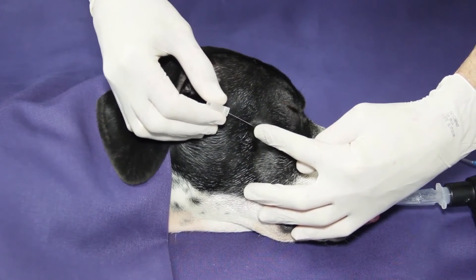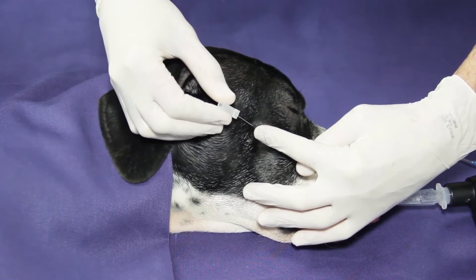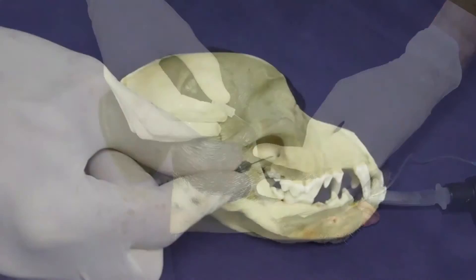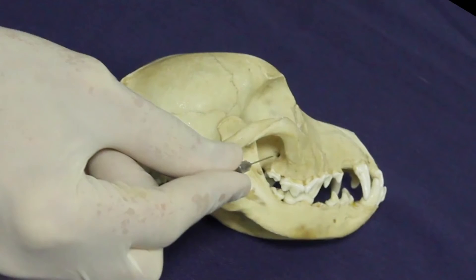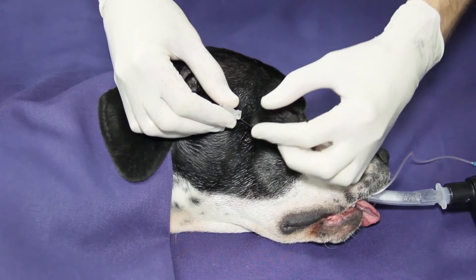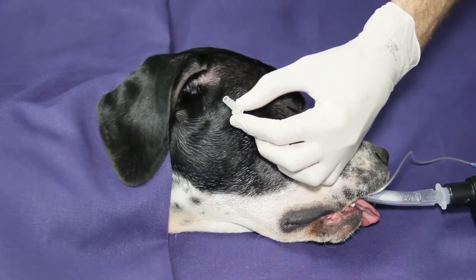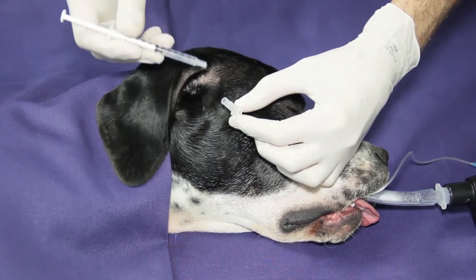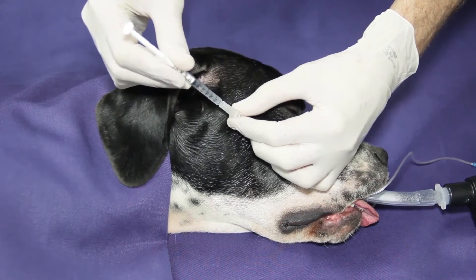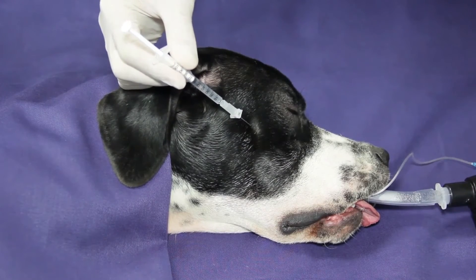The depth of needle insertion can be estimated by measuring the perpendicular distance from the skin to the medial aspect of the last molar. The needle should be directed towards the pterygopalatine fossa. You should aspirate prior to injection to avoid an accidental intravascular injection of local anesthetics and other complications such as hematoma formation.